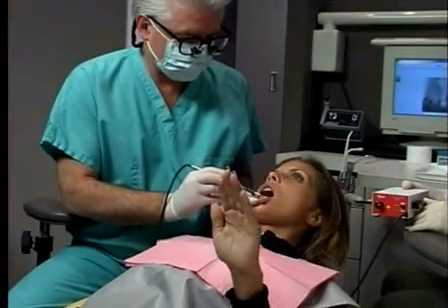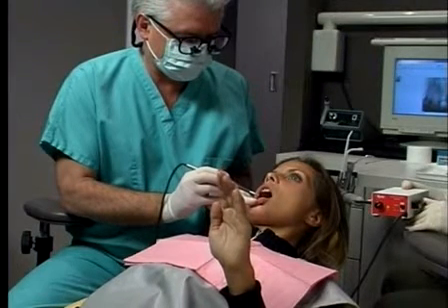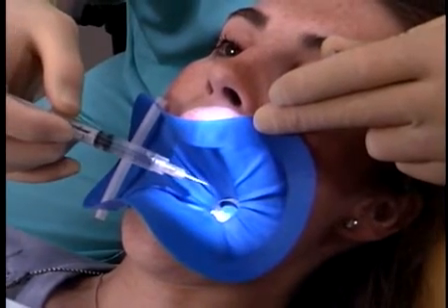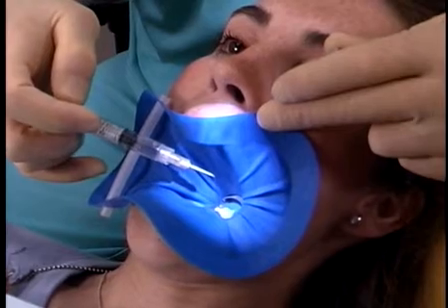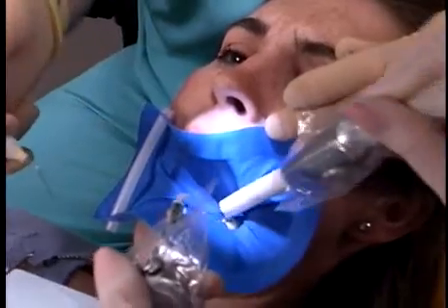Hand signals are an excellent way to identify healthy teeth from pulpitic teeth. Again, we're looking for the immediacy, the intensity, and the duration of each response. In some instances, the hot test that was just described does not adequately reproduce the patient's chief complaint. In these instances, we should carefully isolate the tooth and syringe hot water over the tooth because this will bathe the tooth more circumferentially.